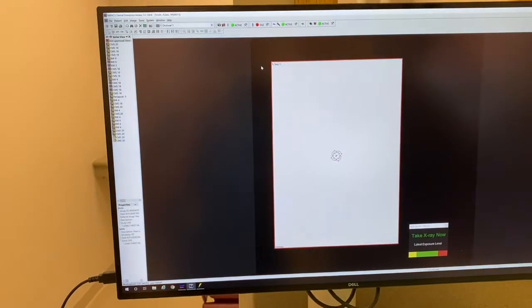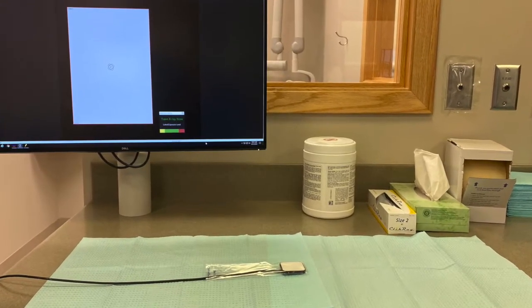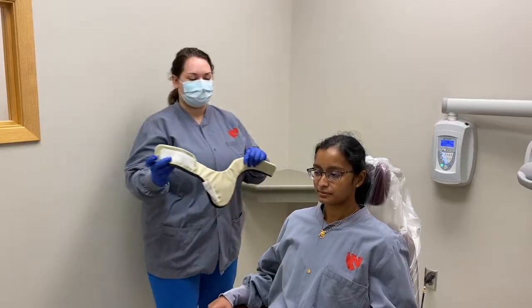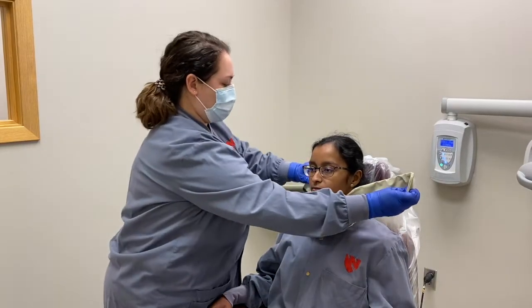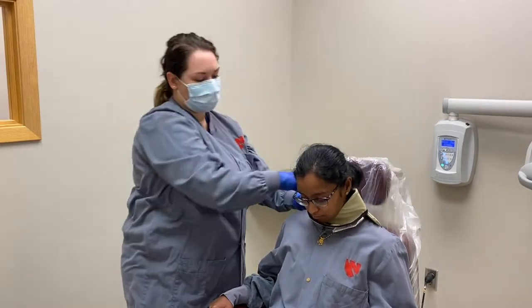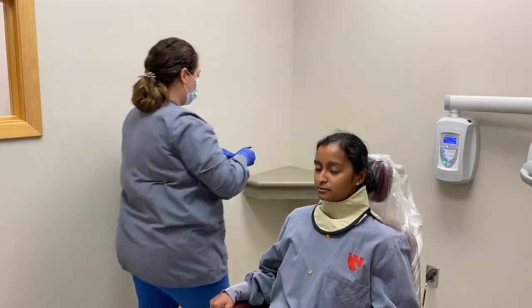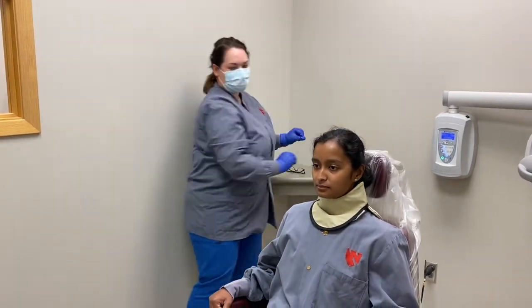Be sure to open a new template before starting. Properly position the adult patient upright in the chair, place thyroid collar on the patient, remove glasses, and remove things from the mouth like dentures, retainers, or chewing gum. Explain to the patient that you will be taking a mandibular occlusal radiograph, which is used to capture the mandibular anterior region.